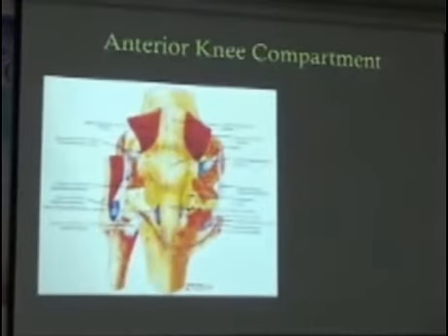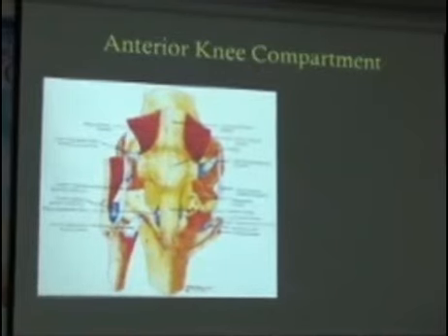So, just some anatomy slides. So, once again, we're looking at the suprapatellar area with the quadriceps and the infrapatellar area with the patellar tendon.